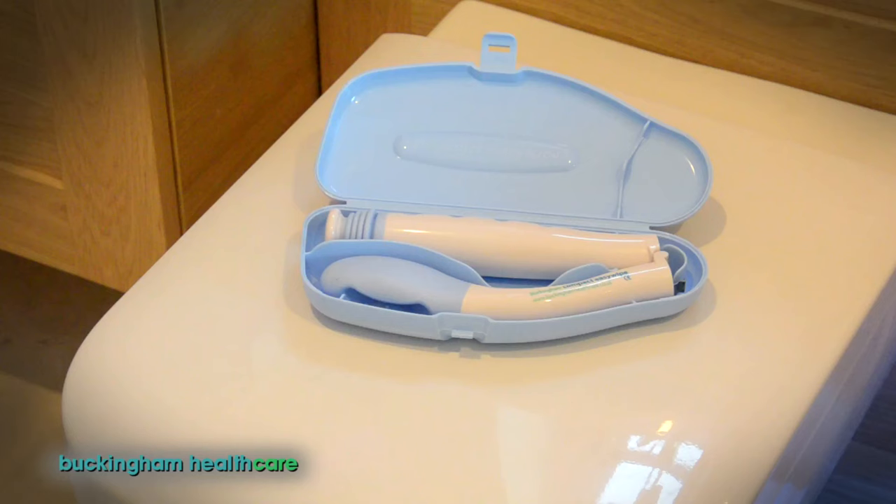This is the Buckingham Compact Easy Wipe, designed in the UK by occupational therapist Chris Buckingham, and here's how to use it.